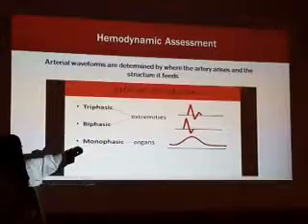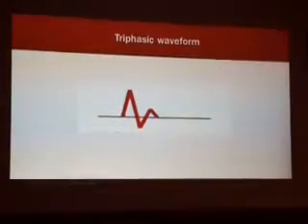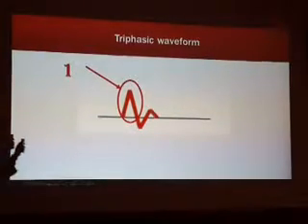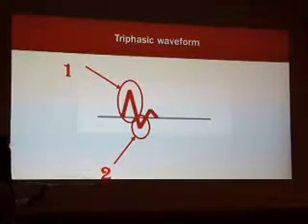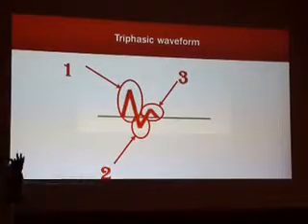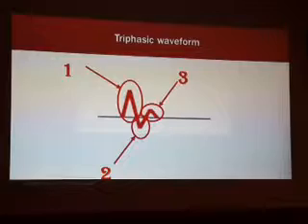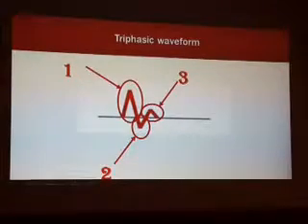ايش يعني triphasic وايش يعني biphasic؟ triphasic يعني waveform عندك 3 peak. عندك systole، عندك another diastole اللي هو below the baseline، بعدين another peak above baseline. So to say it's a triphasic لازم يكون عندك هذه 3 peak، أو 2 peak. نقول هذا في الايه في البريفرال.